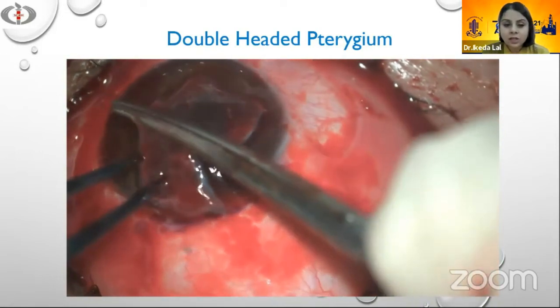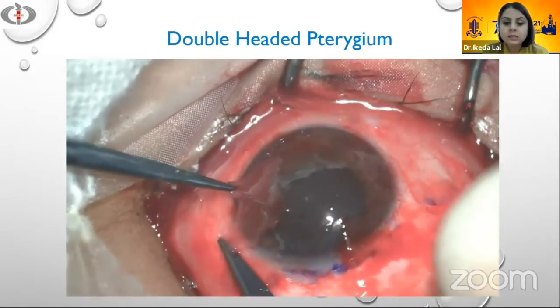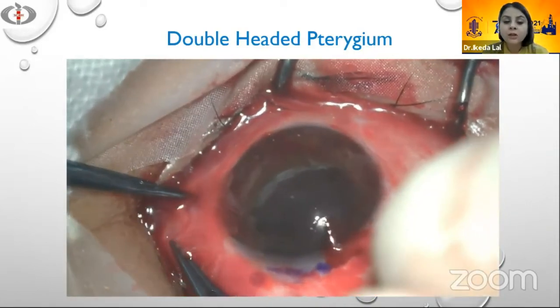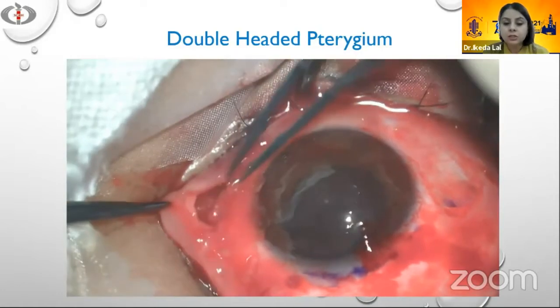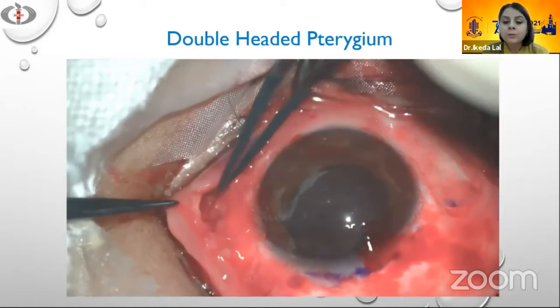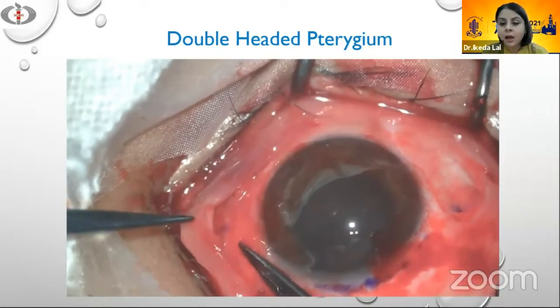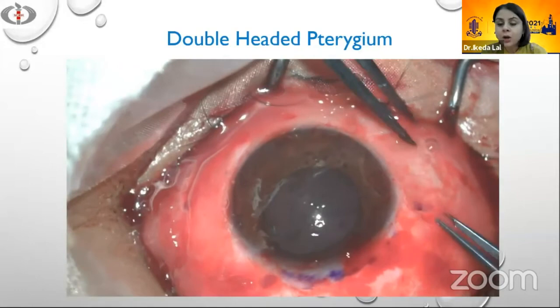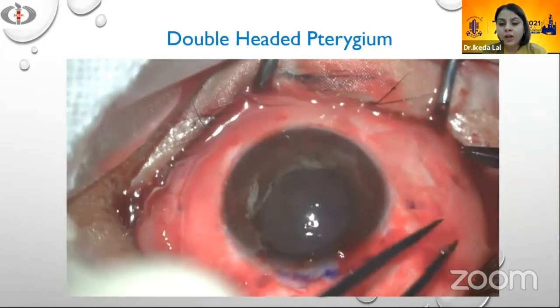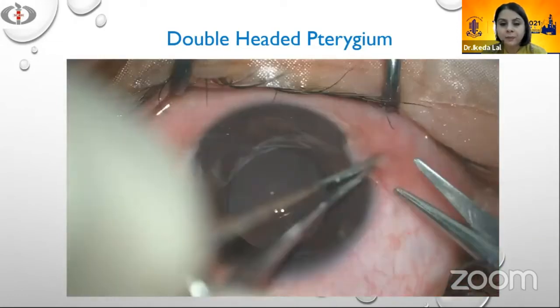After getting the conjunctival autograft, we are dividing it into 2 and then securing it in place using the fibrin glue. If we had to use sutures here, it would definitely take us much longer to finish the surgery. With the glue, this becomes very easy. It can be ironed out very nicely, and we can see that the apposition is also good. So at both the sides, we have managed to harvest enough autograft to secure it in place. And this is the end of the surgery.